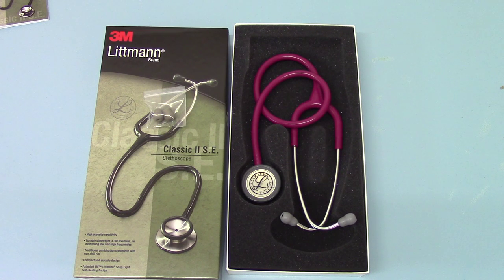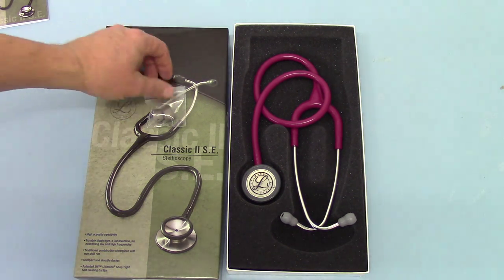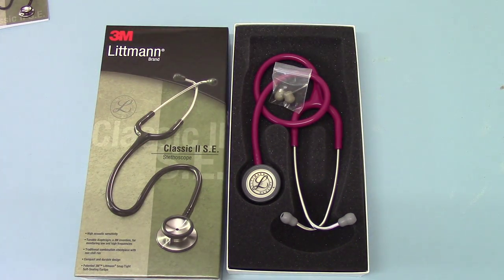So there you have it — the Classic II SE stethoscope from 3M Littmann. This model variation is the raspberry tube option. These models are still in manufacture. Littmann have brought out the Classic III stethoscope, which is a more expensive option with slight design modifications, available as an alternative. But this still represents excellent value for money and excellent quality for day-to-day medical requirements for a doctor's stethoscope. These units are available to purchase from the valumed.co.uk website.